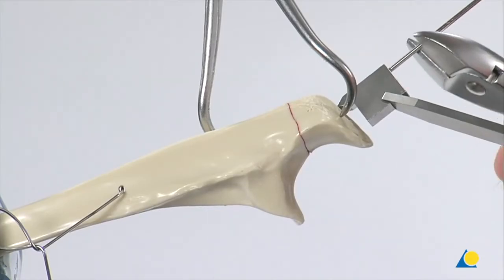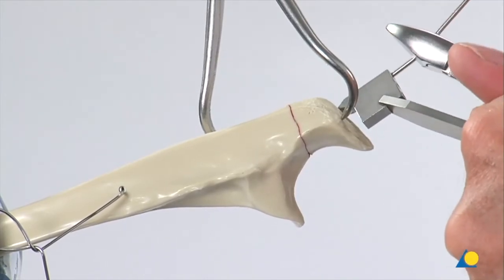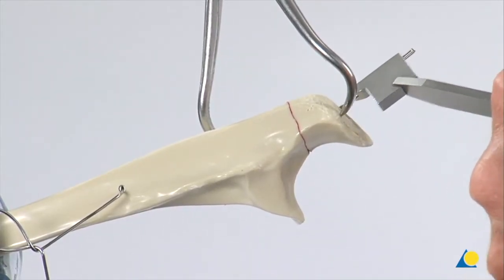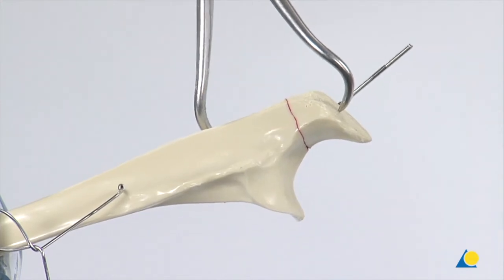Using the wire cutters, the K-wire is now trimmed obliquely about 1cm above the drill guide. The drill guide is removed. The reduction forceps is now removed.